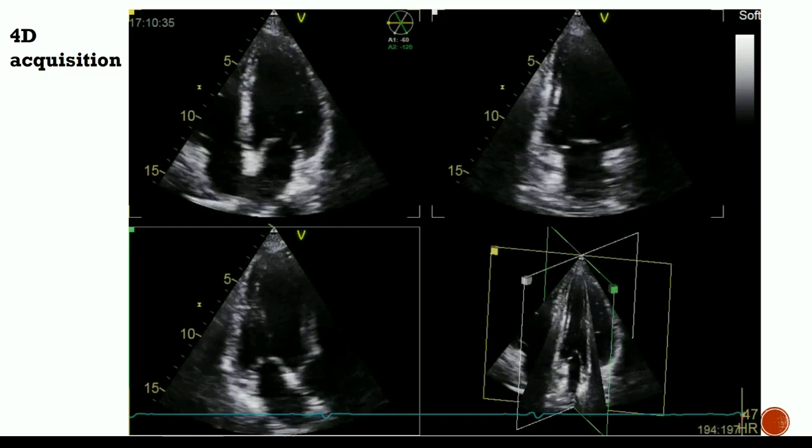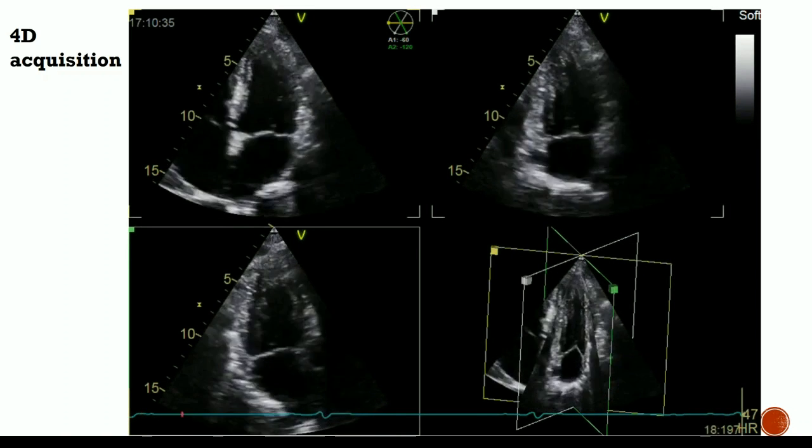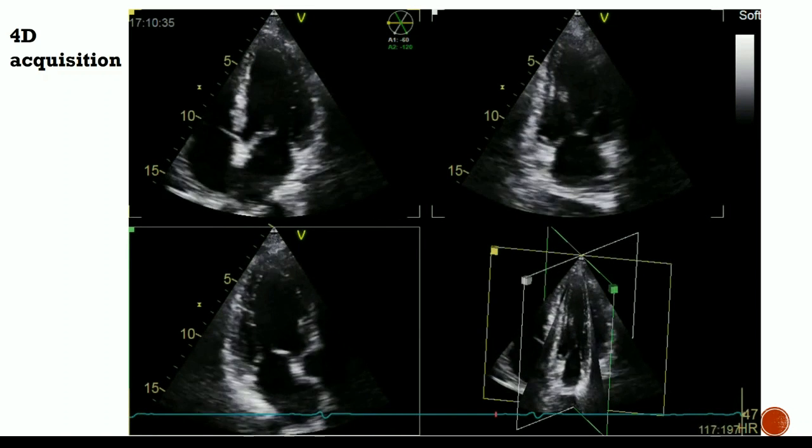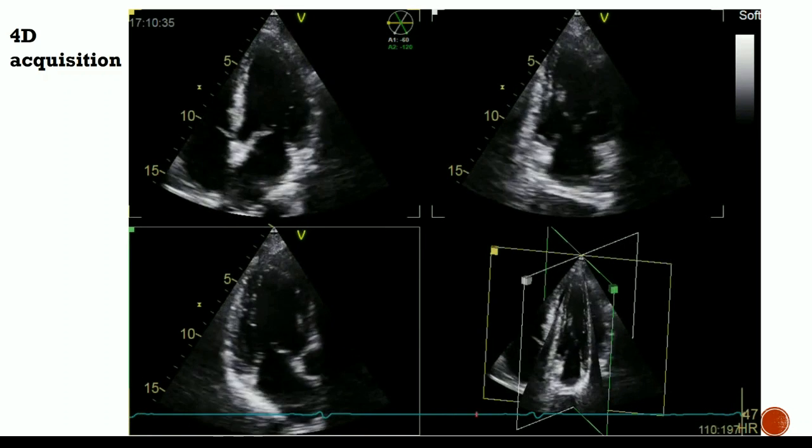And so that's what they measured here. I think some vendors do mid-wall speckle tracking. I think like ours here, some do endocardial speckle tracking. And so there's even differences among that way. So, I mean, absolutely correct.